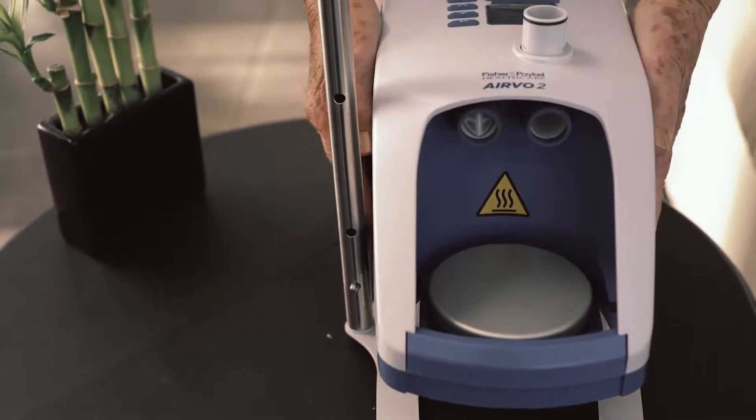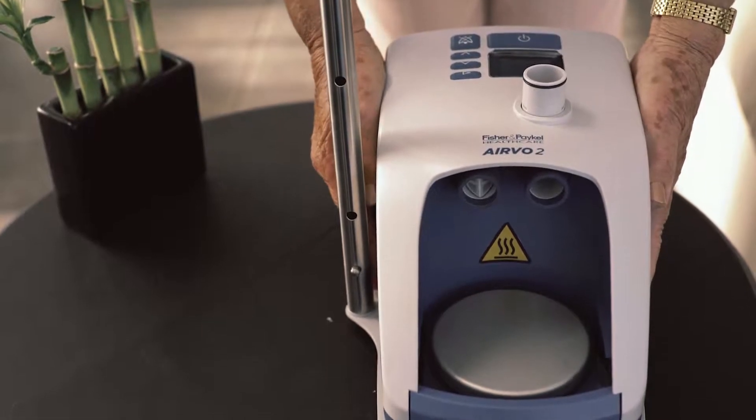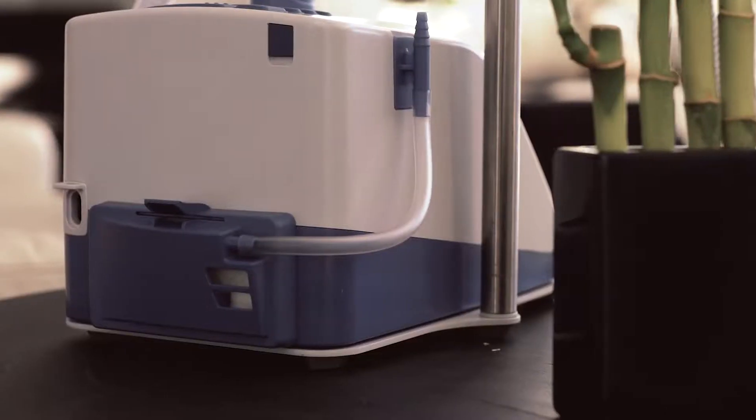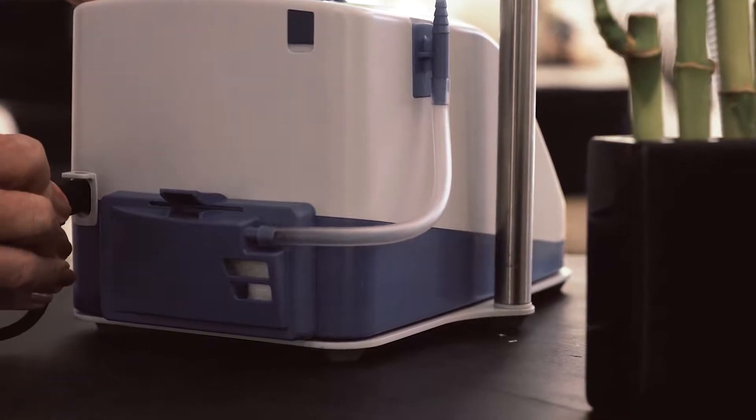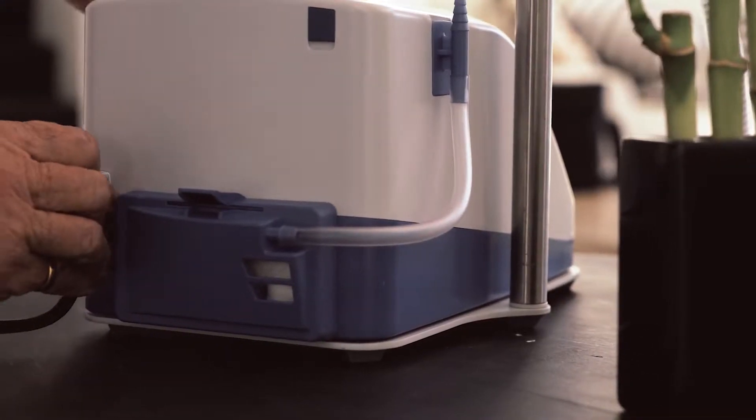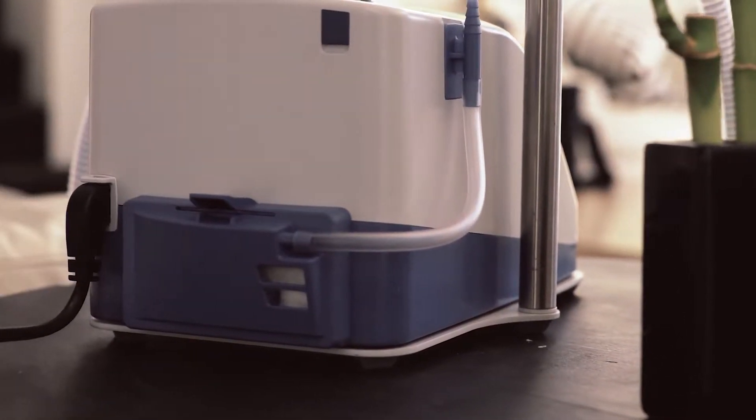Before your therapy can begin, place the myAIRVO 2 on a flat surface below head height. Position the device so the power cord connection to the power supply is easily accessible and able to be disconnected.